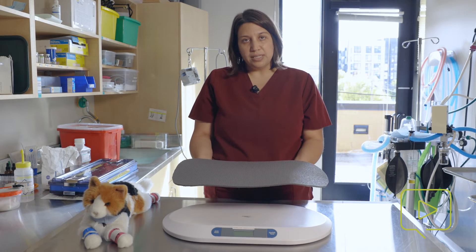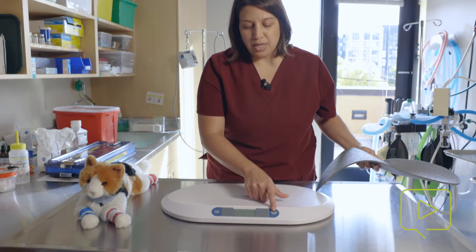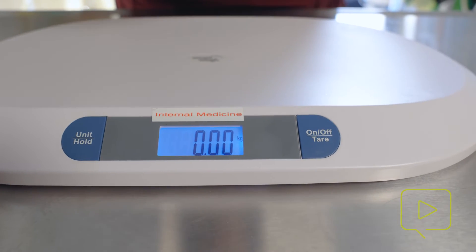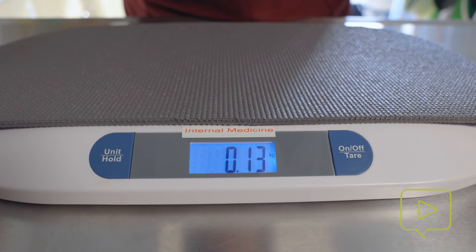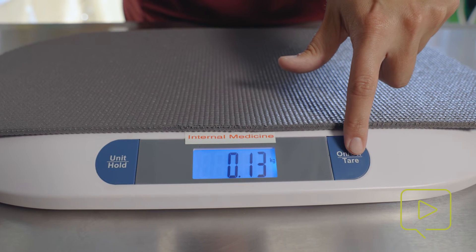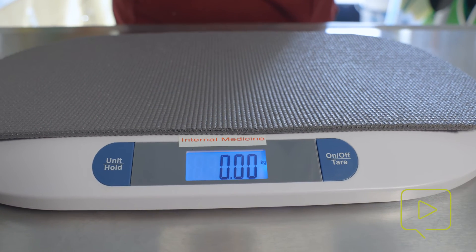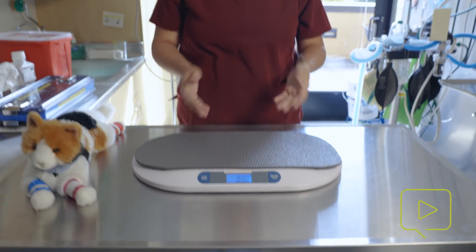We have to consider the weight of this mat. When we turn on the scale, it will start here at zero, but if I put this mat on, it changes the weight — and that's not the weight of the patient. So I need that to be back at zero. That's when I use the tear button: I hit tear and it will zero it out, and now it's ready for the patient. It's important to always tear your scale. It may not be a non-slip mat, but it could be something like a scared rabbit wrapped up in a towel that you're weighing together — afterwards, you need to weigh the towel and subtract it. Anything that goes on the scale that isn't the animal needs to be considered in their end weight.